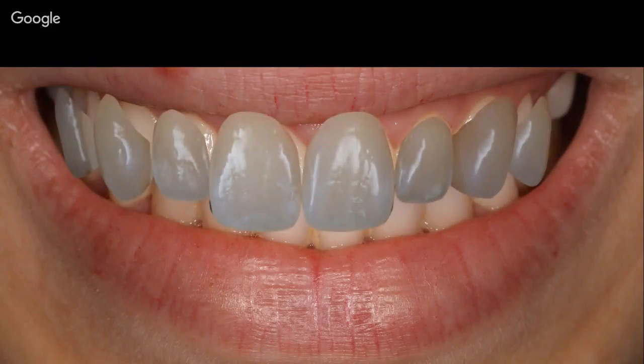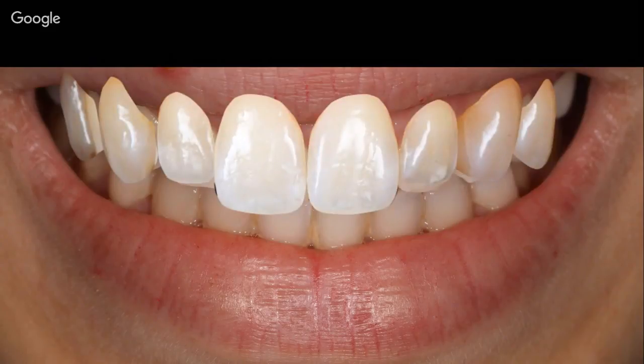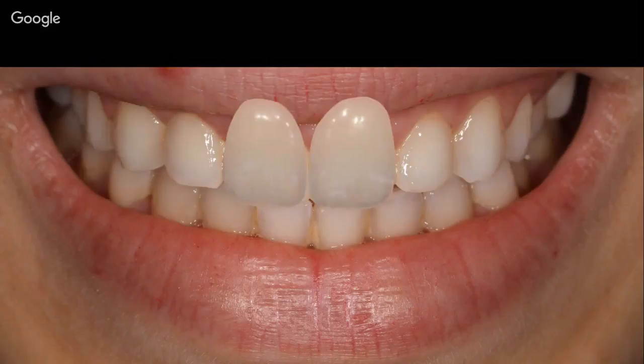This is the template right from its folder. It's dark, and it's not aligned. So of course, you are going to align the teeth individually one by one, and you're gonna put them there. But after you put them and you show Mira that picture, she's going to be slightly confused because she said she wants 2 restorations, and now you have 8. So obviously you are going to remove them and just put 2 central incisors.